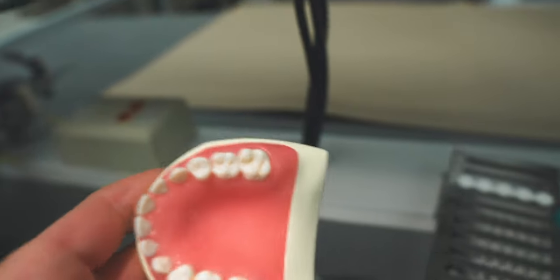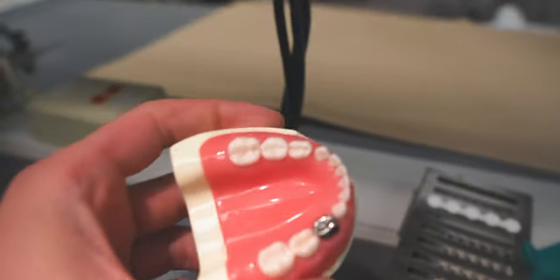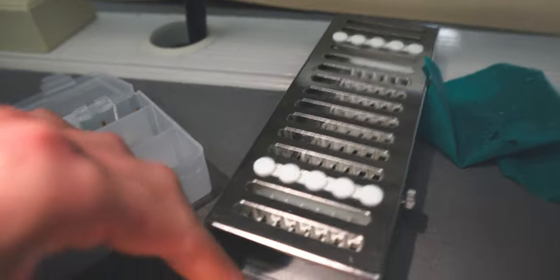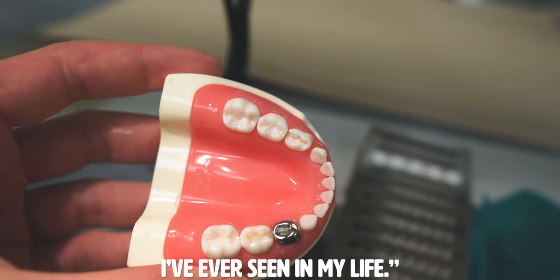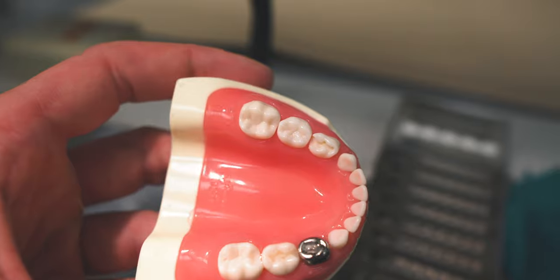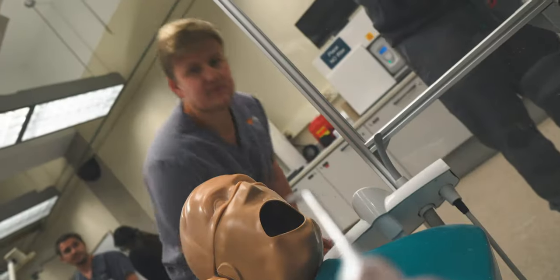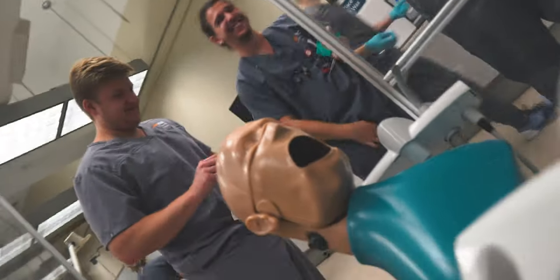One thing I've realized is that when you're cutting on primary teeth, the margin for error is a lot smaller. I don't think these preps are very good, but it's tough — if you make one little mistake you're in big trouble compared to cutting on an adult tooth where you have a lot more room to work with. Just a couple of amalgam preps here. I also don't know what the class one portion of a tooth L prep is supposed to look like because I've never cut a tooth like that, so I have no idea if that's right.